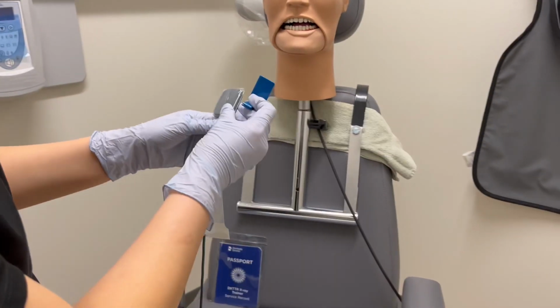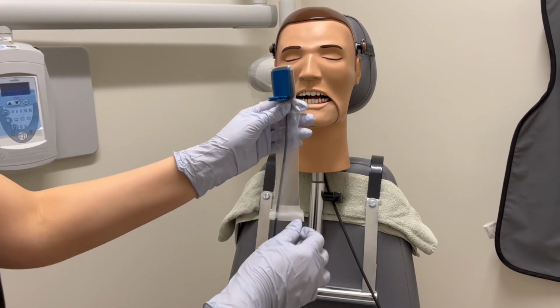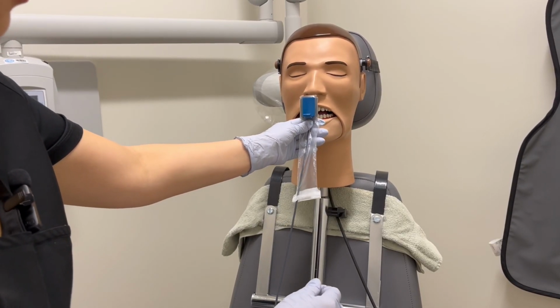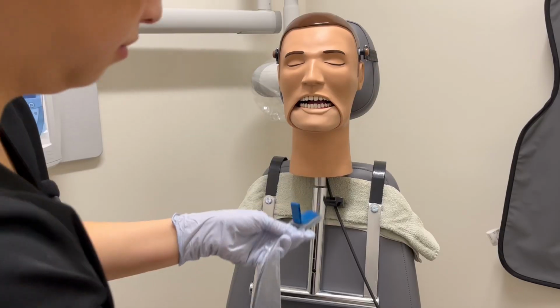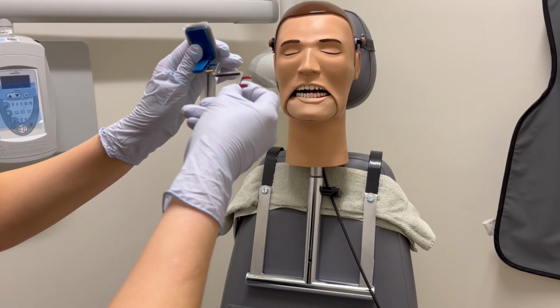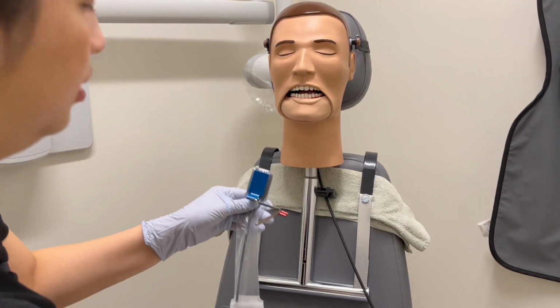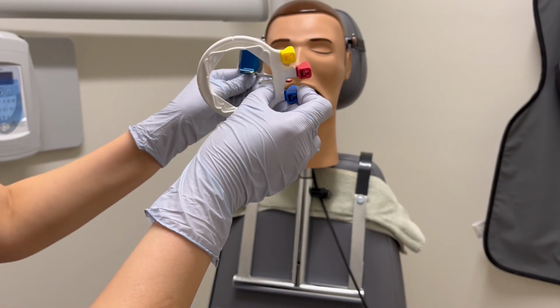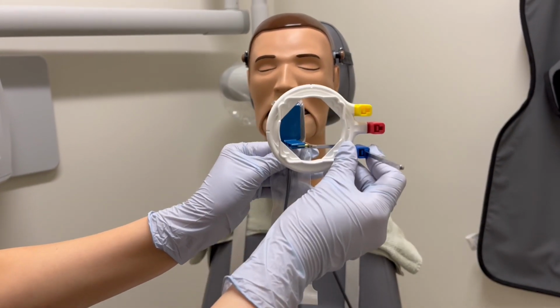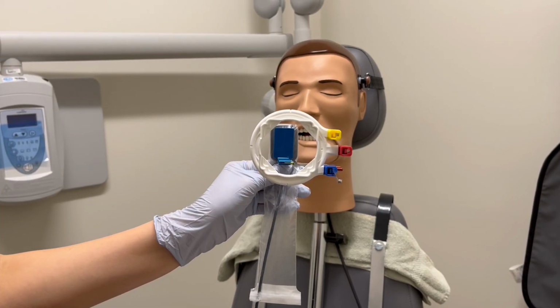For anterior PAs, if you're using the universal RINN, same thing, you're going to place the bite block on. Anterior PAs, sensor is held vertically. Then comes the prongs. The blue prong is going to go inside of the bite block. Last step is attaching the plastic ring. So blue with blue. Sensor has to be smack down in the center of the plastic ring.